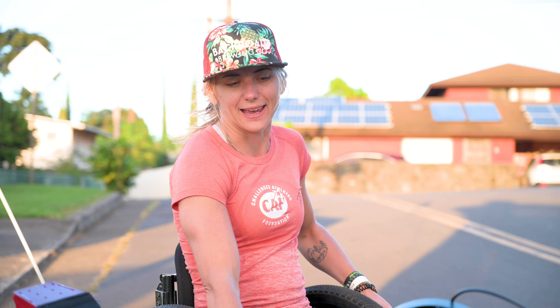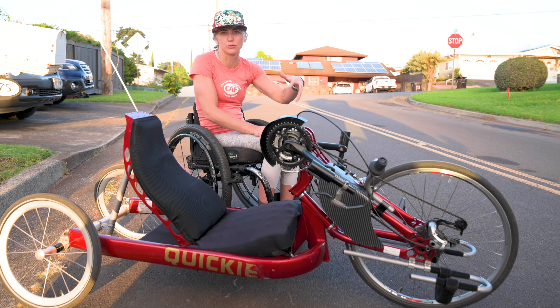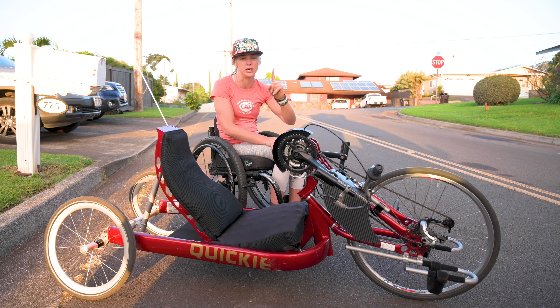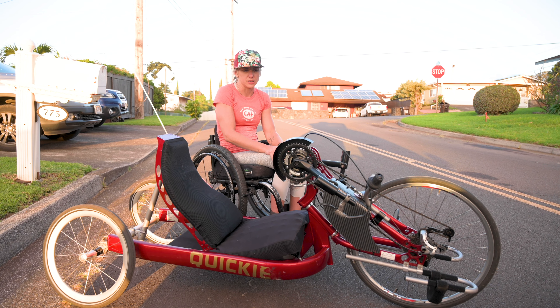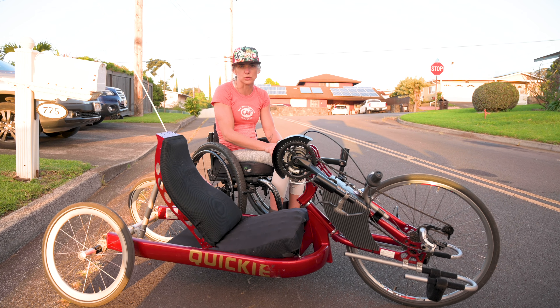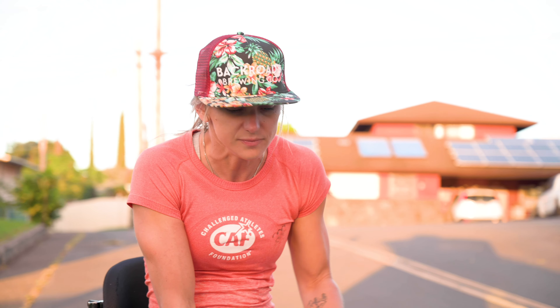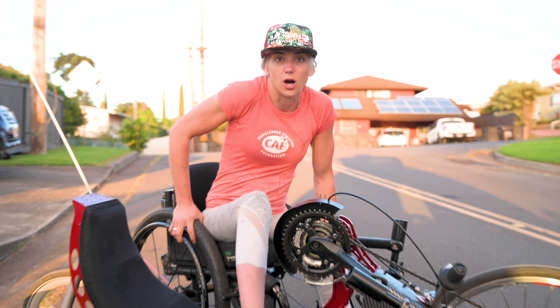Pro tips for paras. In the adaptive world we deal with so much really pricey equipment, so it's great to have friends that loan it out. Thank you number one to Daryl Tate — in Maui, his dad Jamie opened the door for us, so we were able to commandeer his bike. They're not easy to travel with. I still don't have one of my own at home because they're expensive, so mahalo — thank you.